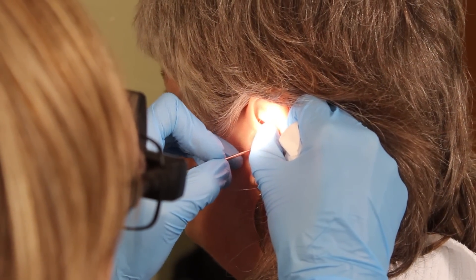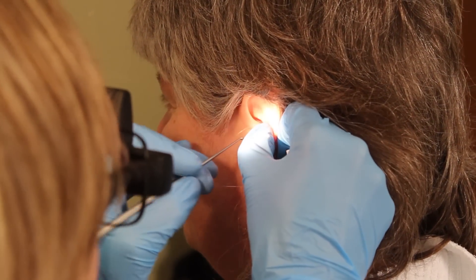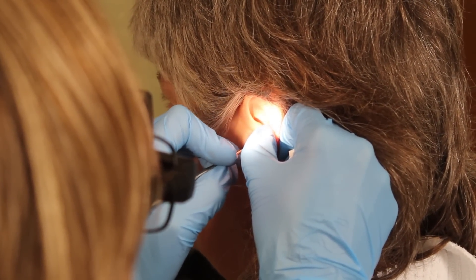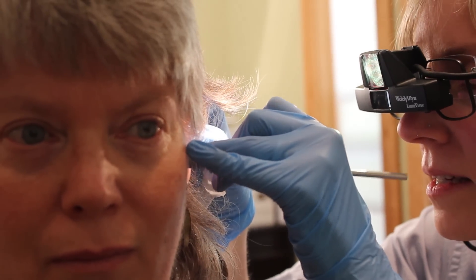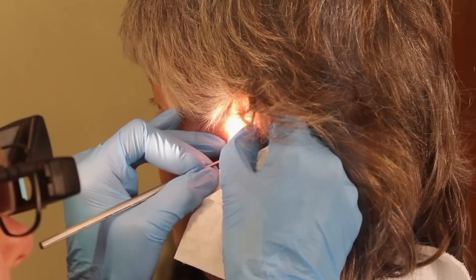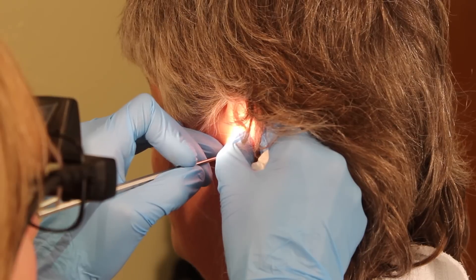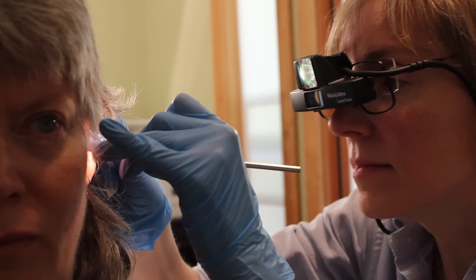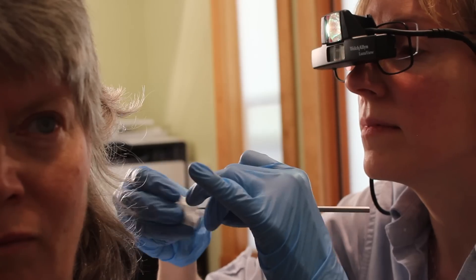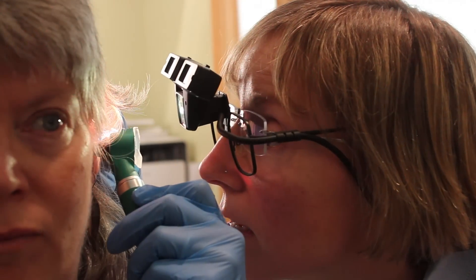I'm just working at the very entrance here. Are you okay? Just tickled — really tickled. Both ears are completely separate from one another, so one can be more sensitive. It's going onto the bone there. I can feel that. Okay, that is all. Looking good. We'll just take one of the kit and make sure it fits. Nothing left behind.